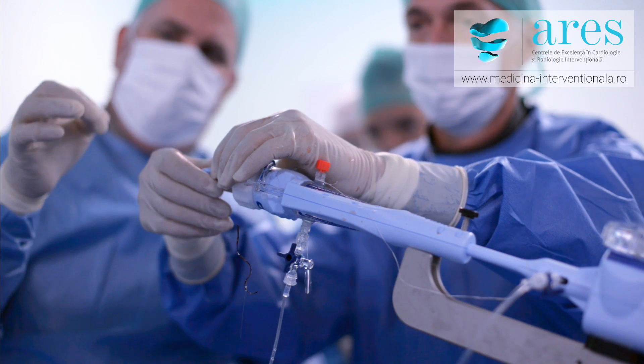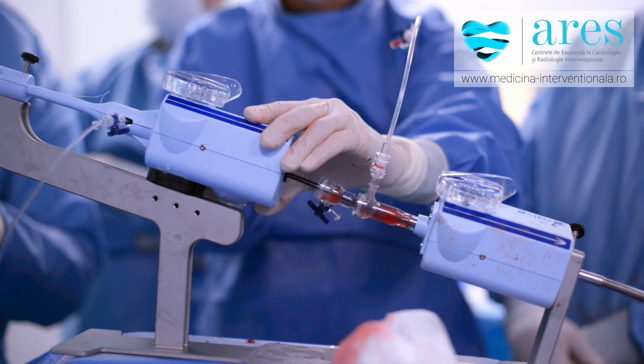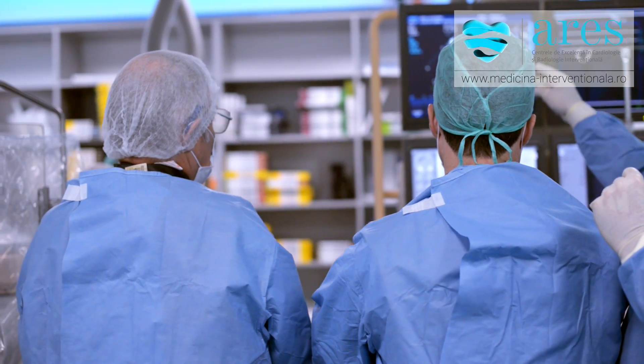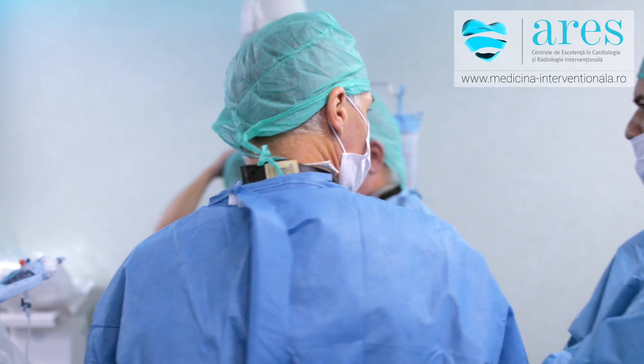We don't puncture the artery, which is one big concern. The arteries are vessels with very high pressure, so when you puncture them you have a risk of bleeding. We don't have that risk of bleeding with this procedure because we puncture a vein, which is a low pressure vessel.